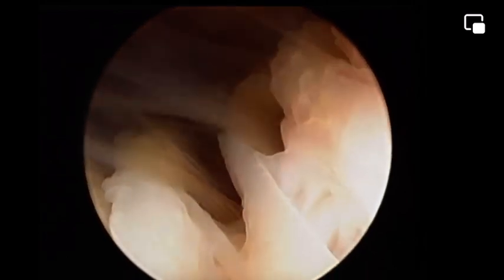So slowly going through the cervical canal, don't go quickly, otherwise the cloudy mucus will cover the lens and you might go into a forced track or a perforation. So the very important first tip in insertion: give it time and use whatever proper or maximum fluid jet to clean the cervical mucus. Direct the tip of the telescope toward the cervical glands, and that will help in squeezing the mucus out from the endocervical gland.